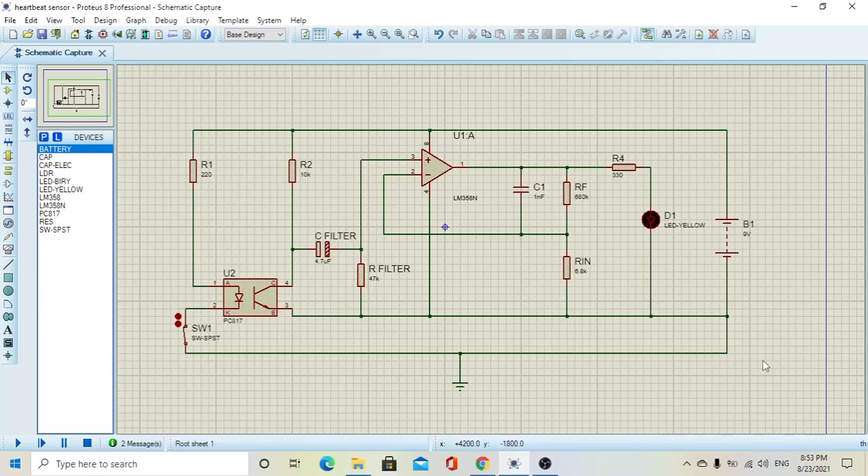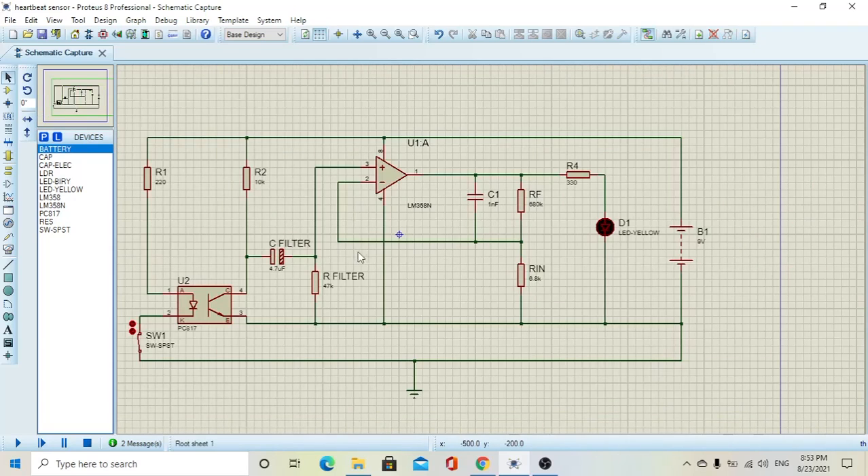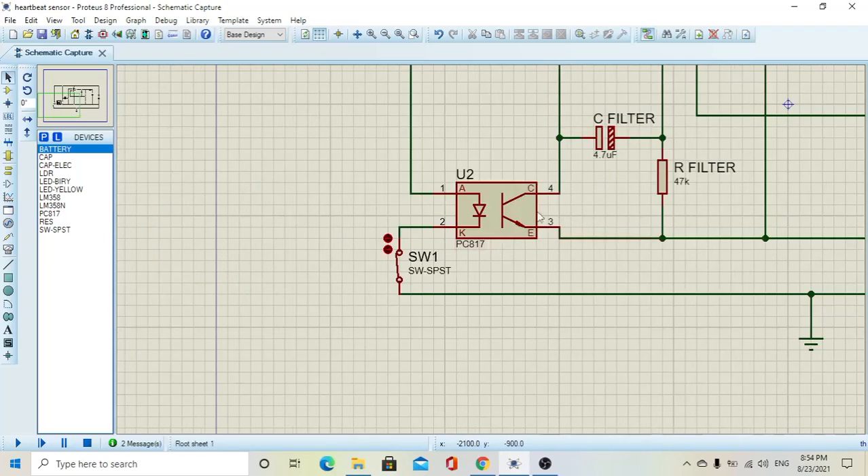Right here I have connected the circuit using this application — the circuit of the heartbeat sensor. We have the power supply, a 9-volt battery or any power supply that supplies the circuit with 9 volts DC. And we have right here the LED that tells us if the heart is beating or not, and the heartbeat sensor.